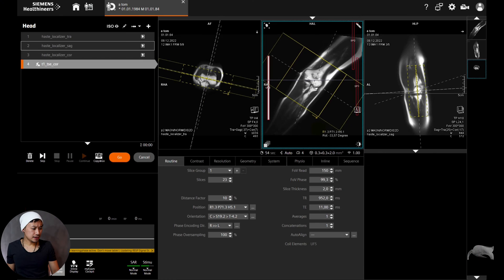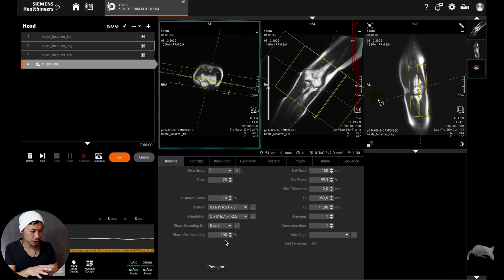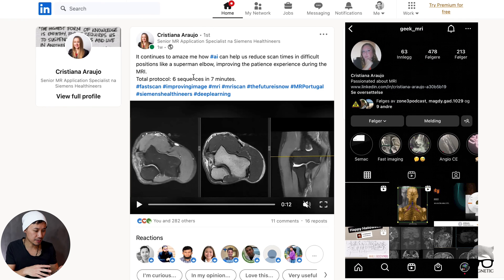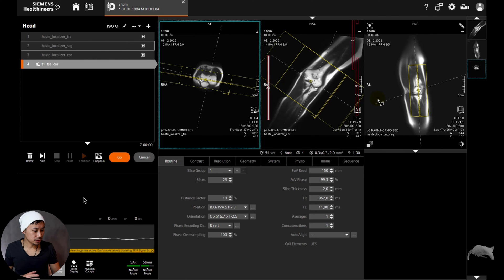Now let's do some live scanning. I've done three sequences for all three positions so we can compare images later. The scan time is only 54 seconds — this is real because I'm using Deep Resolve Boost, which gives high resolution in a short time. A friend of mine, Christina Raiju, posts great cases on LinkedIn and Instagram using AI for elbow imaging — you can see insanely good images with six sequences completed in just seven minutes. That's only possible because of AI and Deep Resolve Boost.